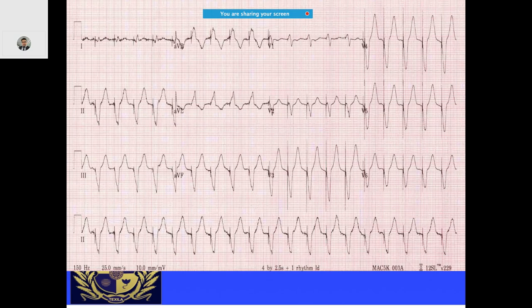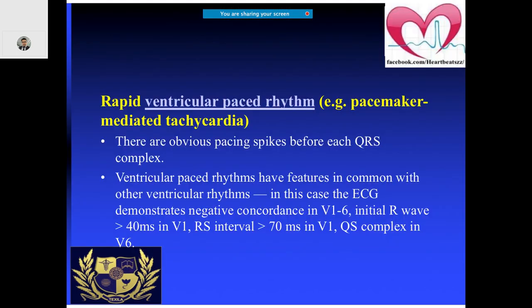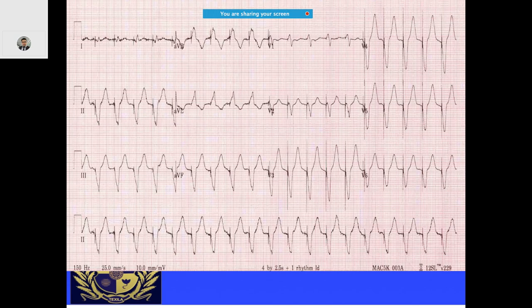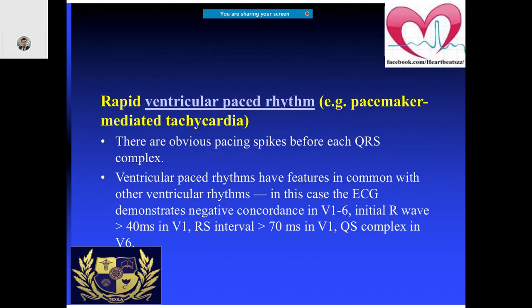In this ECG, you can see a pacing spike — a right ventricular paced wave. There is left bundle branch block. The R wave is more than 40 milliseconds, the RS interval is longer, and there is also a QS complex.